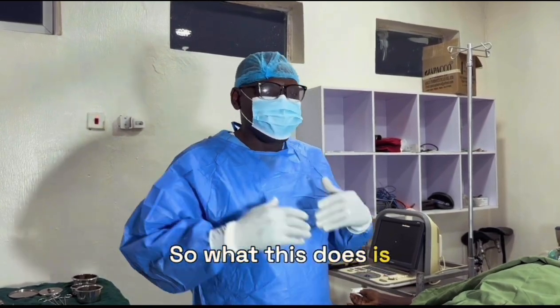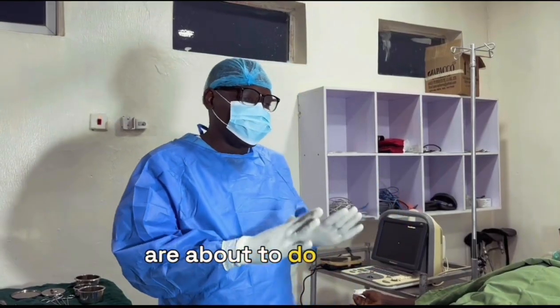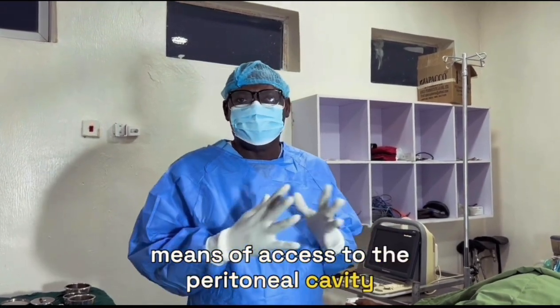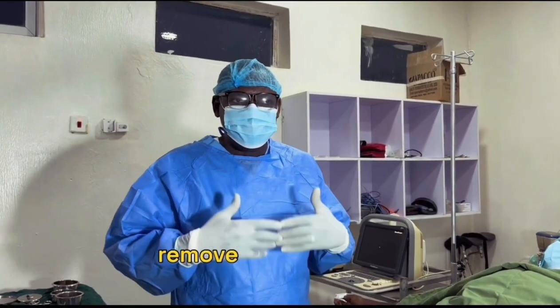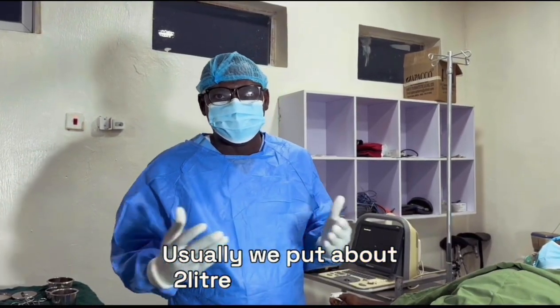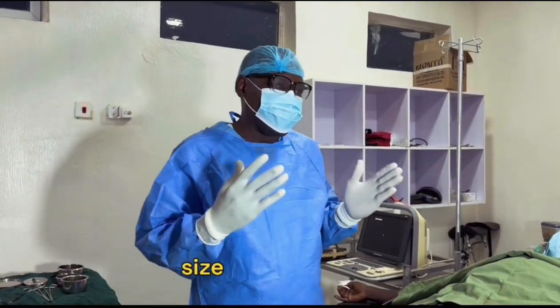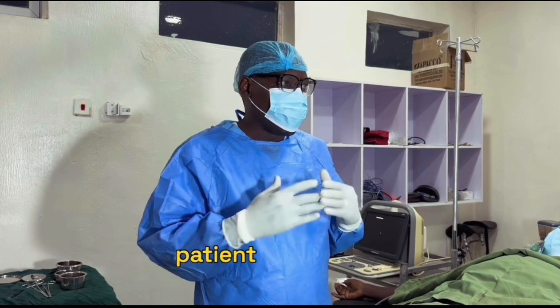So what this does is that we'll put in a flexible tube, and this flexible tube which you're about to do now will be used as a means of access to the peritoneal cavity. The patient uses his own body as a filter to remove the waste, and that happens at the peritoneum, the abdominal cavity. Usually we put about 2 liters of fluid in the peritoneal cavity, and that is about the size of regular bottled water. Too much is not too burdensome. The patient will carry it and walk around with it.